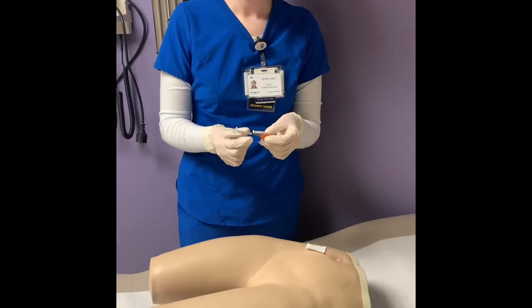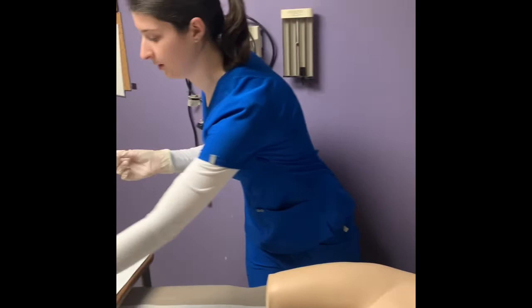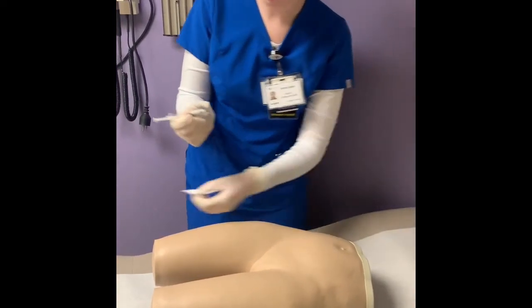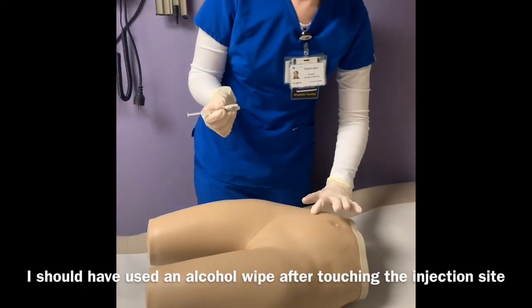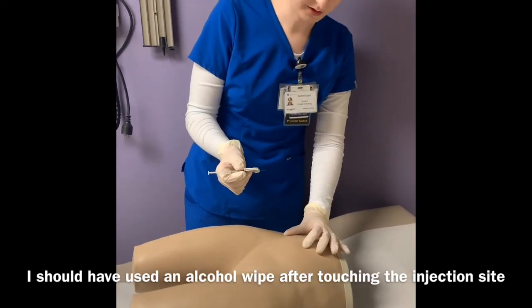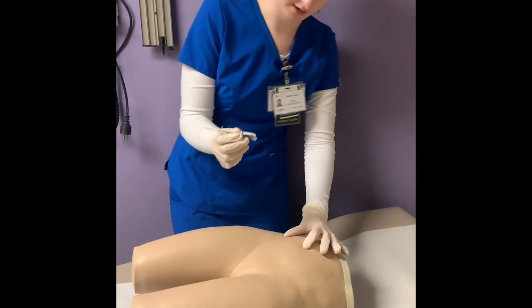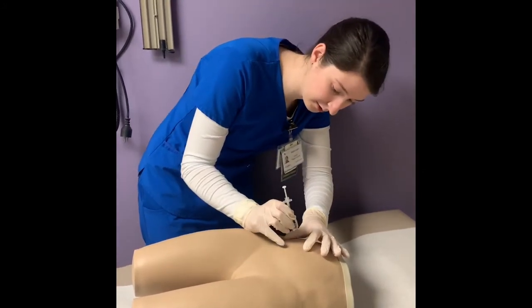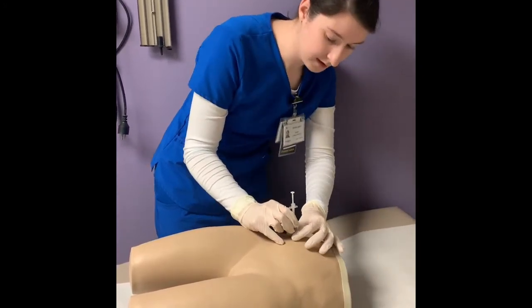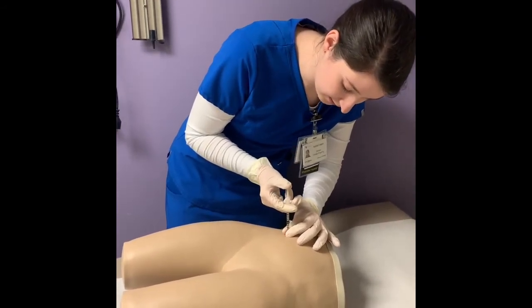Okay, so I'm ready to administer this medication. So I'm gonna go ahead and remove the cap, put it to the side. I'm going to remove the alcohol swab. My location is right here. I'm going to pinch up the skin. I am able to pinch up 2 inches of skin, and so I'm going to deliver this injection at a 90-degree angle. All right, on the count of 3, I'm going to give the injection. 1, 2, 3. Okay, now I'm going to stabilize and I'm going to give the injection steadily and slowly.